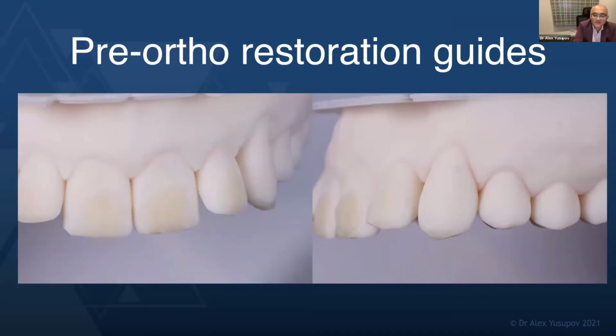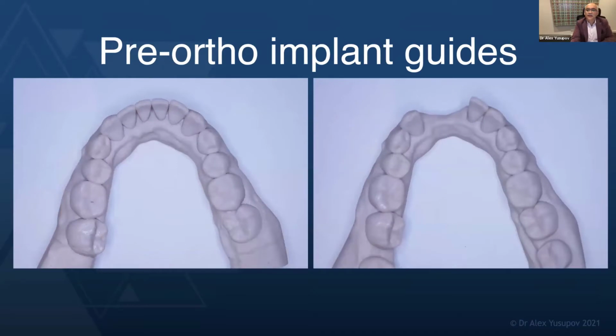The other thing is you don't have to do a lot of 3D digital work to get the teeth just right. Get them close enough and then just use your composite and polish it. So today, instead of trying to find Meshmixer software to get the teeth to look like teeth, I just get the basic structure and then just add a little bit of flowable and polish as we go. And this saves us a lot of time and still gets the same result.